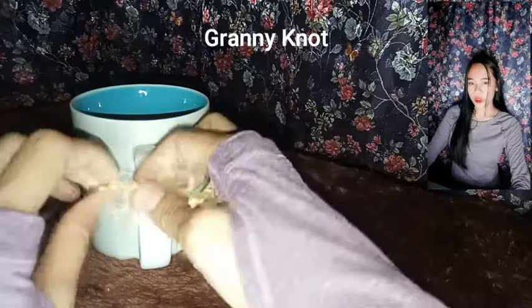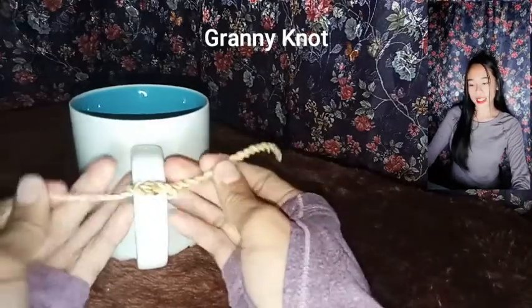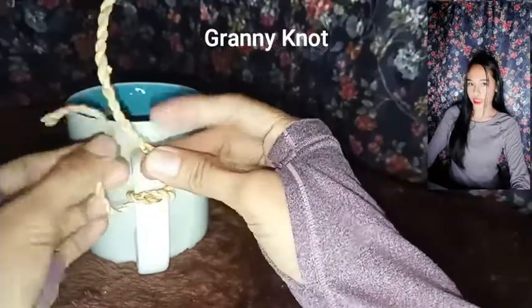Granny knot — it is most often created by incorrect knotting technique and is most likely to slip when compared to the square knot.